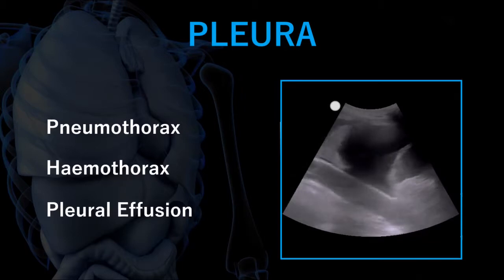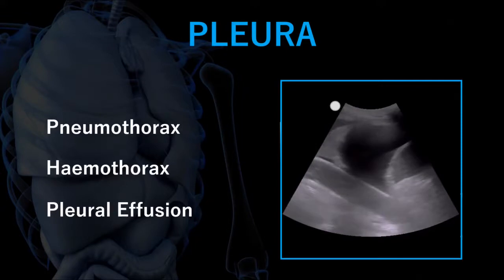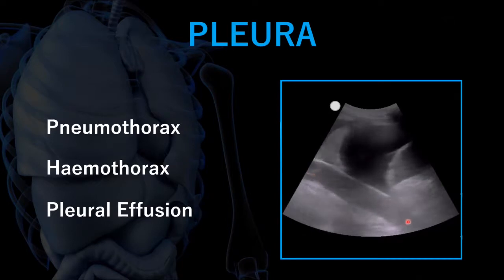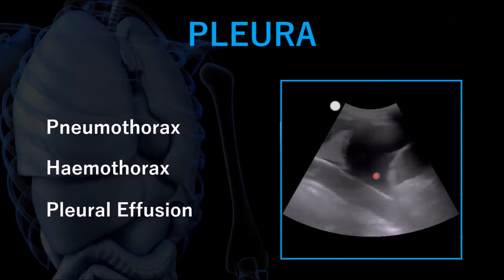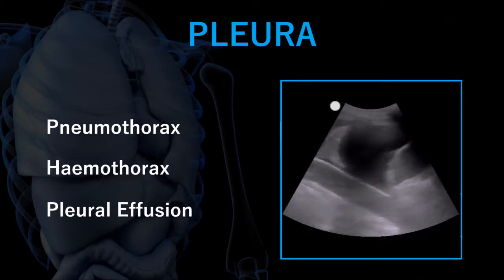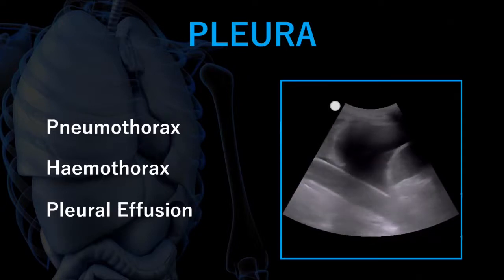Because we've had thoracic trauma and somebody that's potentially unwell, there's always the chance of developing pleural effusions as well. In this image we have the diaphragm with spleen underneath, and that's the aorta running through the image. This is a clear-looking pleural effusion, and this is the lower lobe completely compressed by the effect of the fluid pressure on it.